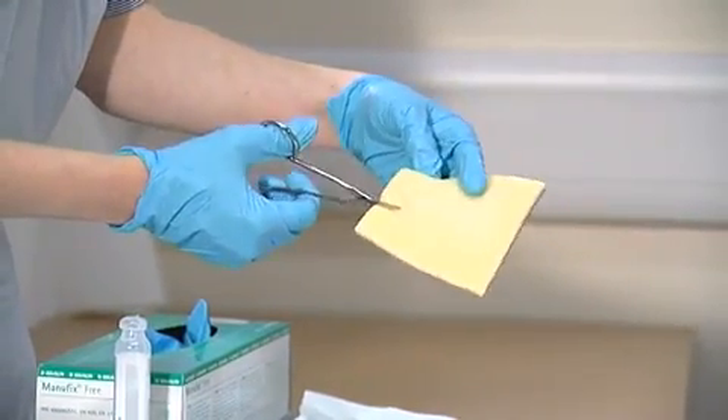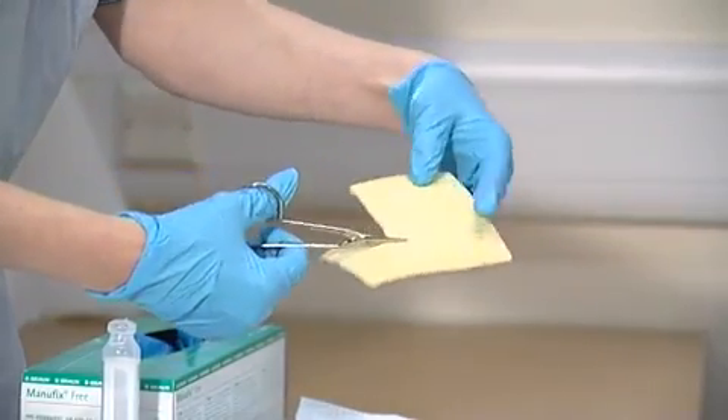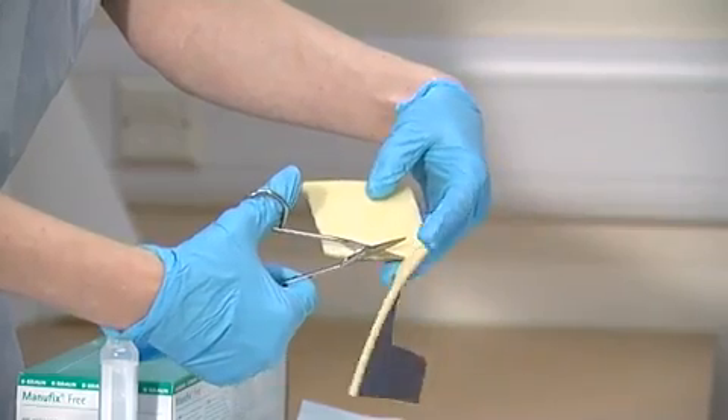For application, it's important to select an appropriately sized dressing. Dressings can be cut to size, or several dressings can be overlapped for large wounds.